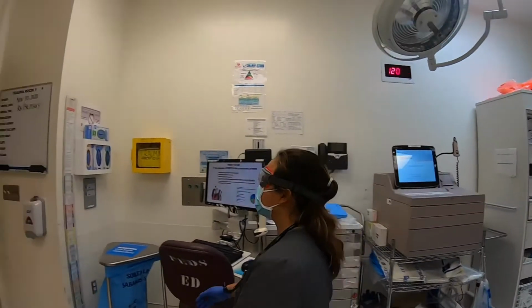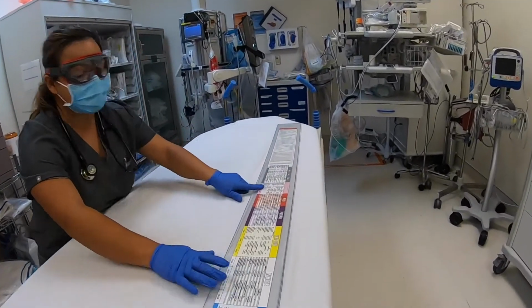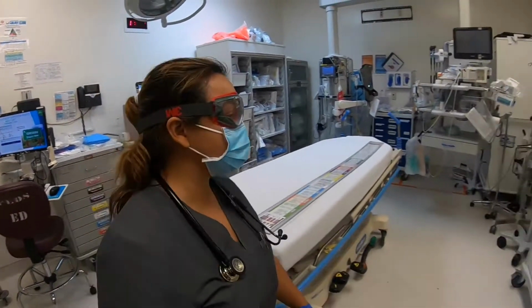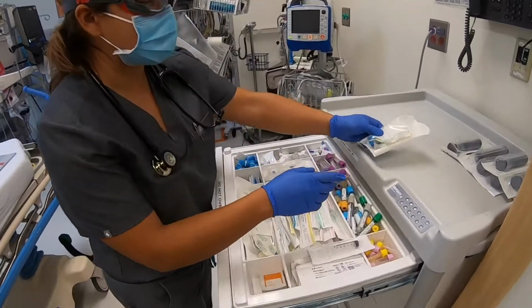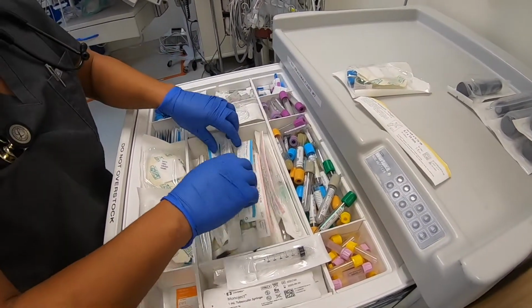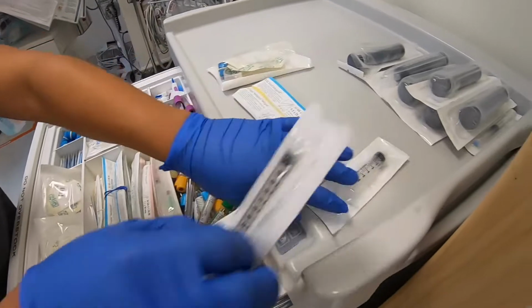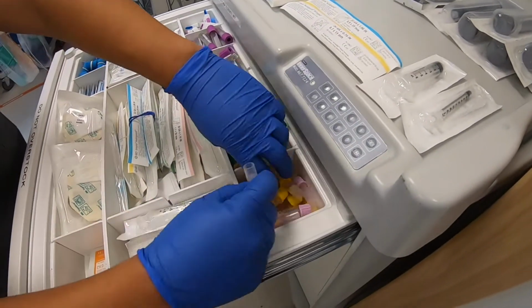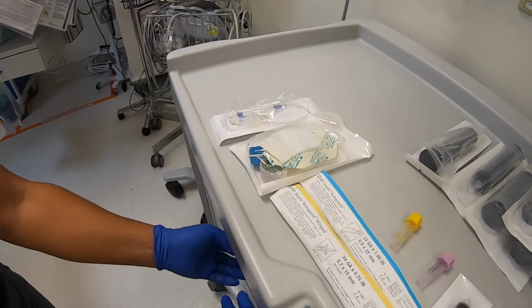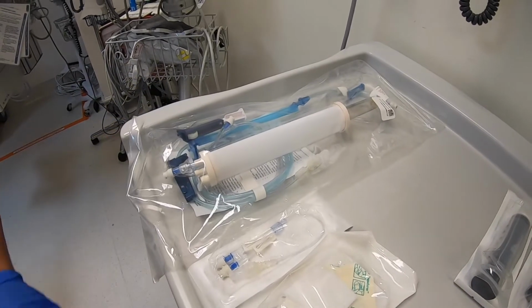All right, I will gather my length-based tape. And pink. I will have my pink card here. Okay, I'm going to grab my IV setup. So I'm going to get my IV start kit. I'm going to get a 24 and a 22 gauge needle in case we can get a bigger vein. We need to get tubes for blood, and then we can use the micro tubes to collect blood, and then IV setup. And then let's just get a Buretrol ready in case we start an IV for the baby.